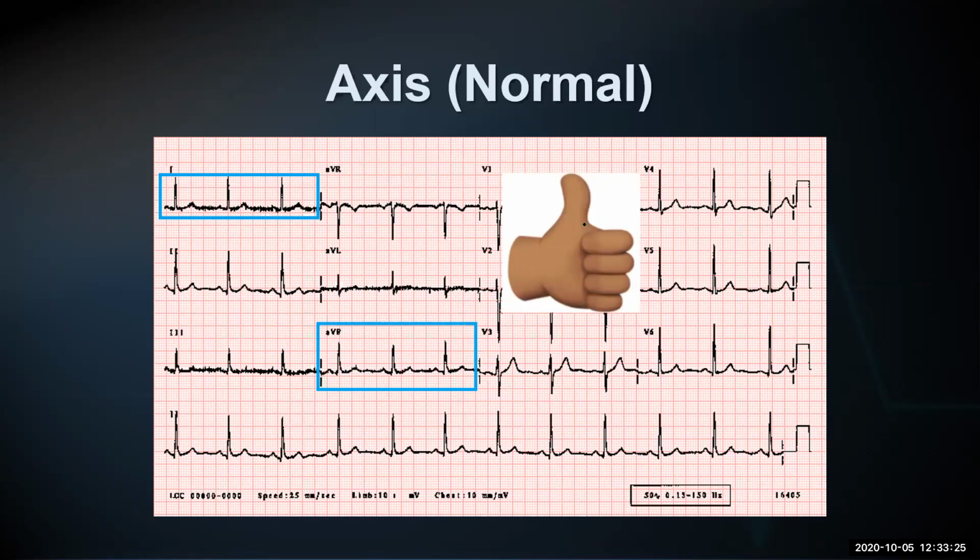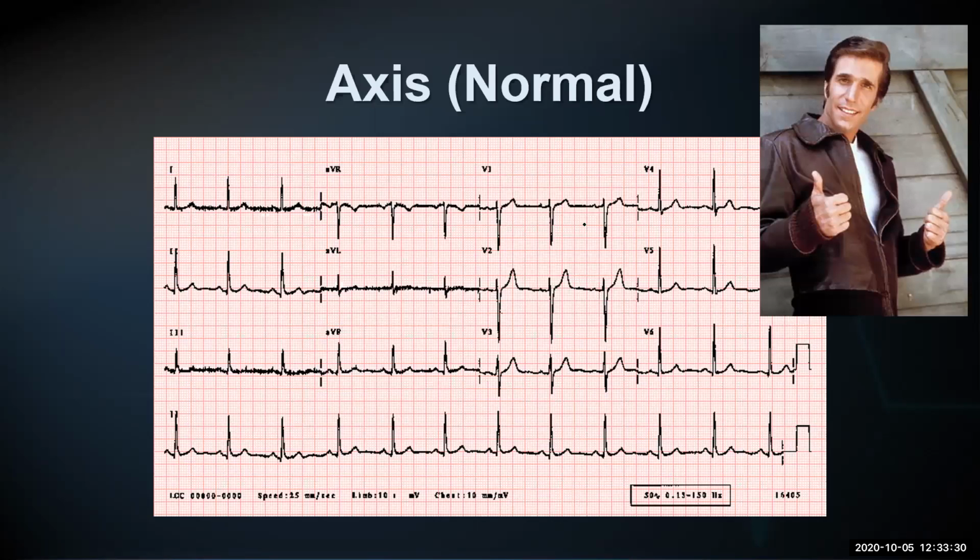So both leads are upright. So you're going to get the, I think this is the Fonzie sign. Did I put Fonzie? Yep, put the Fonzie sign. So you get the thumbs up on both. I did recycle that from last year's.